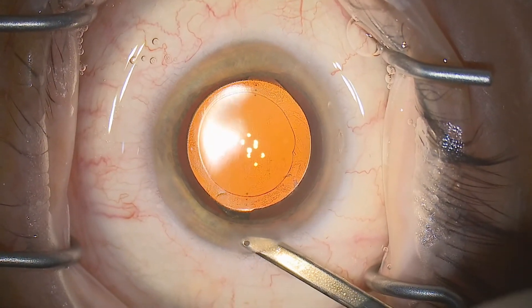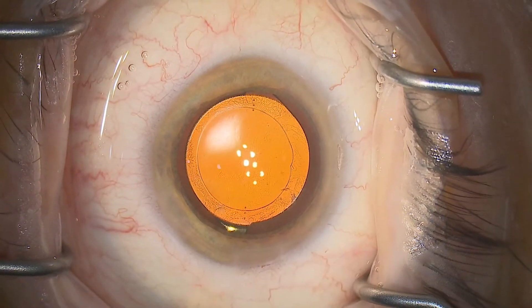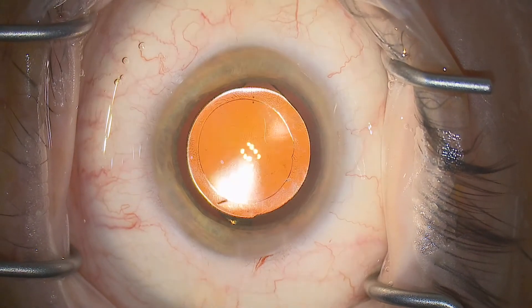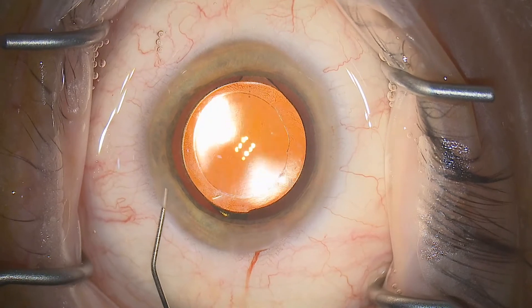Putting this all together at the end of surgery — just kissing the outside of the main entry site with the Simcoe cannula brings the eye to a super-physiological pressure nice and quickly, which is very useful in a vitrectomized eye.